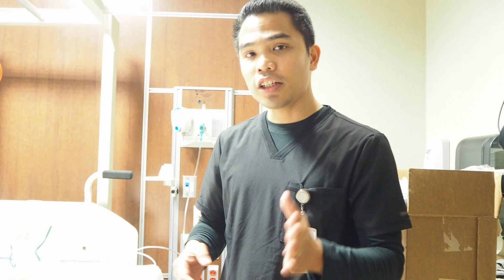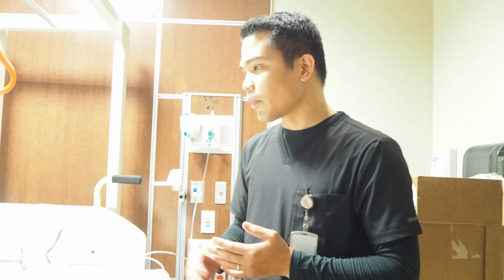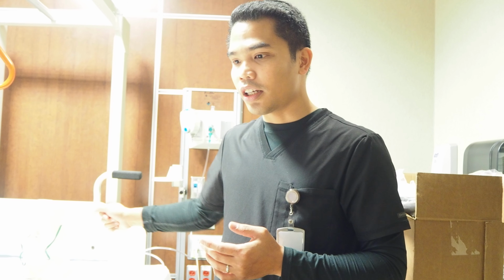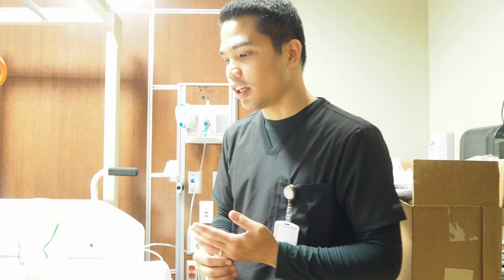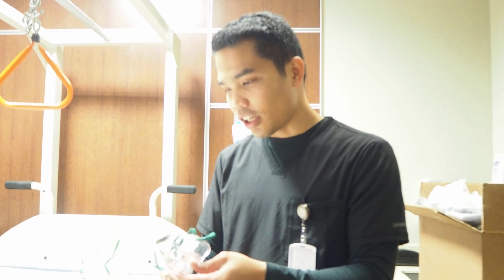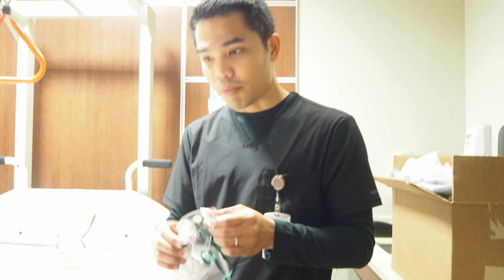So I immediately coordinated with a nurse, and at the same time, good thing the physician was there, that because the patient was being hooked up with a simple mask, I think it is contraindicated for that, especially with the flow of 4 liters, because the patient would breathe more CO2 instead of oxygen. So with that, I recommended to the physician that I will be hooking this one up with the non-rebreather mask.